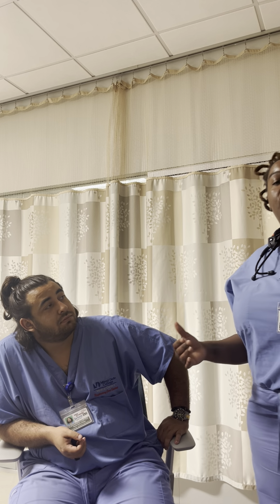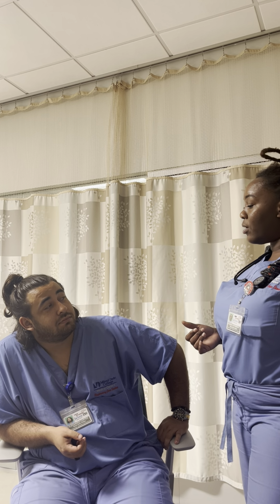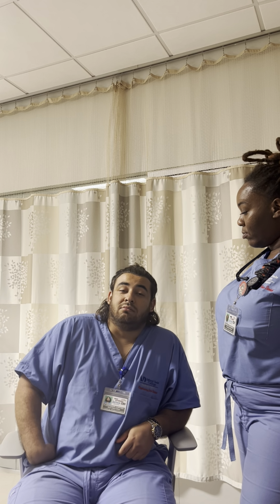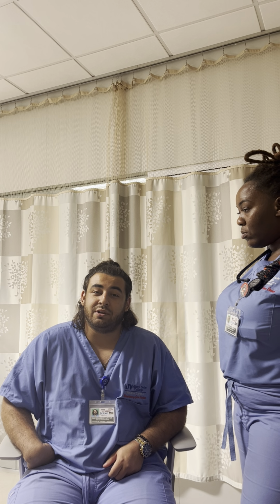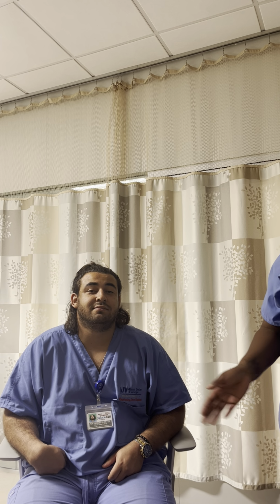So I'm going to verify my patient. Could you tell me your last name and your date of birth, please? My name is Alexander Cortez. My date of birth is 03/04/1999. Okay, thank you. And we verified our patient.